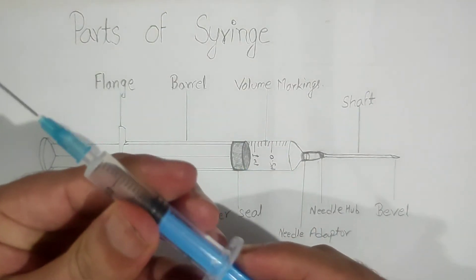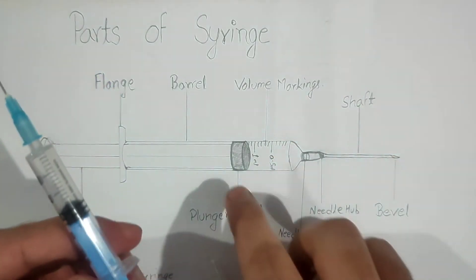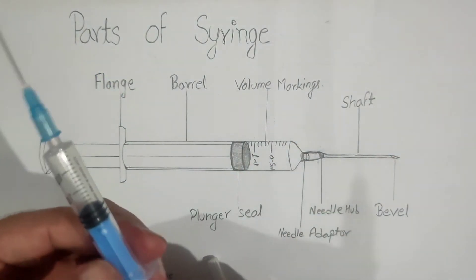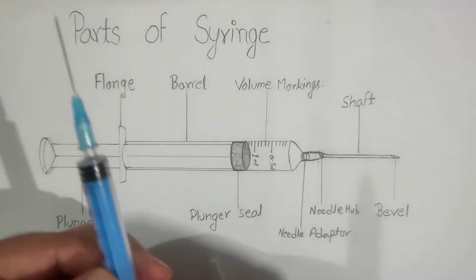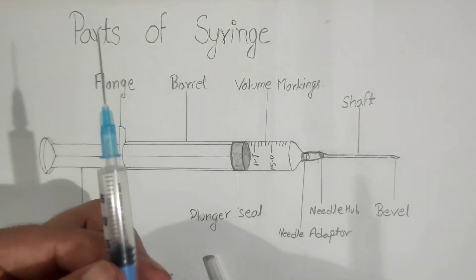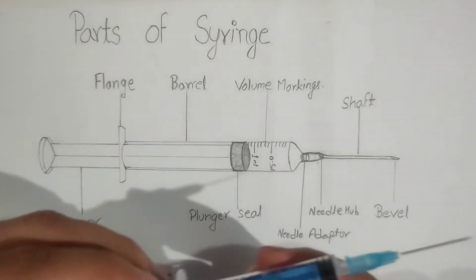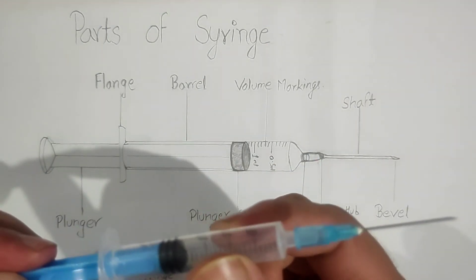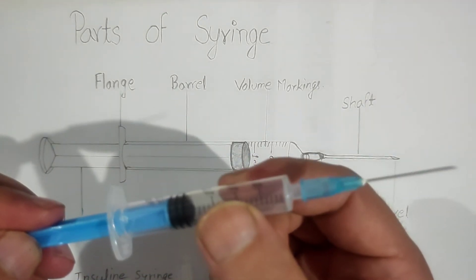This black portion you can see is known as the plunger seal, which is used to aspirate the drug or fill the syringe. And this hollow plastic part is known as the barrel.